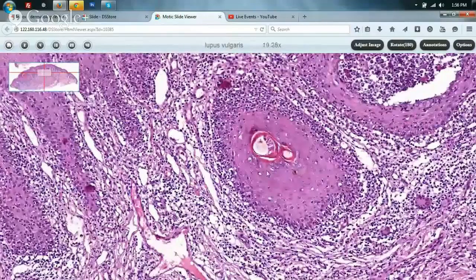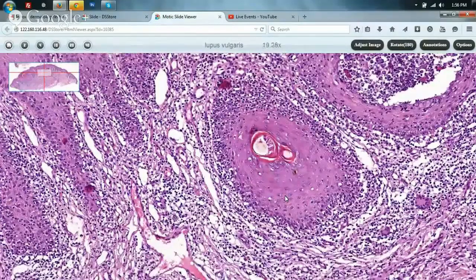In such patients one may consider doing a stain for the organism, but demonstration of acid-fast bacilli is very difficult or near impossible in lupus vulgaris. Normally a report is issued without performing these special stains unless specifically asked for, and the diagnosis would be lupus vulgaris. The basic finding of a tuberculoid structure granuloma composed of giant cells is fundamental to this type of skin infection.